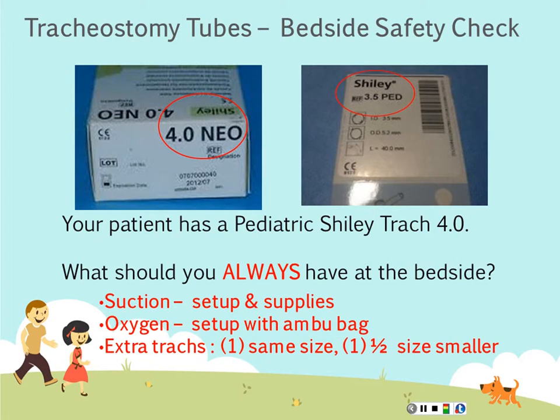If they are in a box, you want to open the box and make sure the trachs are actually in the box. Many facilities will tape those to the bedside, and say they changed out a trach and they popped it out of the box and left the box taped to the bedside. You don't want to wait until you get into an emergent situation and need a spare trach only to find that the box is empty. So you always want to make sure that you've checked and made sure your spares are in the box.